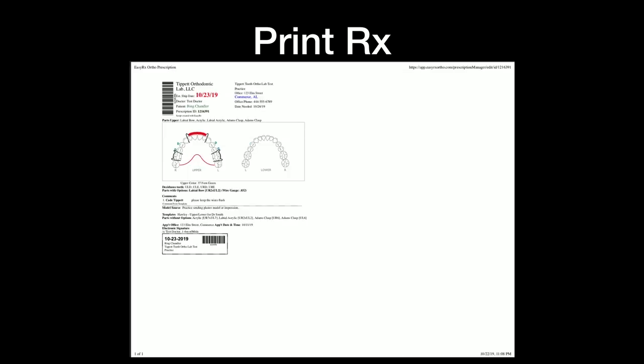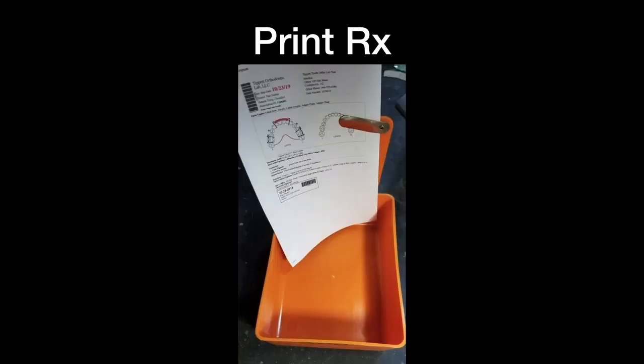But I've come to find out that doesn't fit very good in the case pan, because you fold it in half and then you're looking like this at the case pan and it starts hurting your neck. So actually Sarah came up with this. If you print it in landscape and scale it down to about 70%, 75%, you can actually get it to fold in half and it fits in your case pan. So just like that digital version, all that info is right there, the same info.